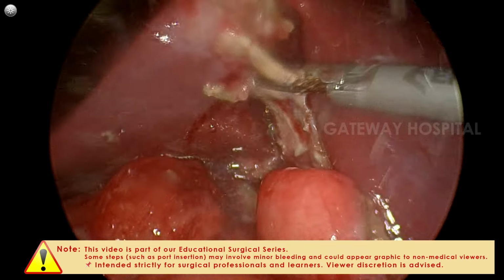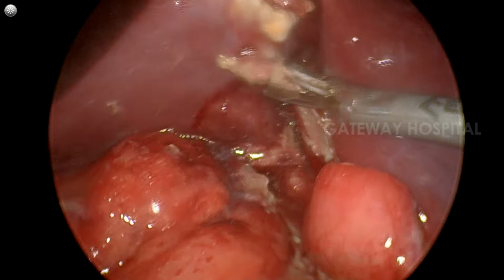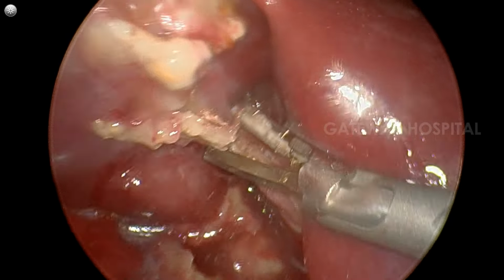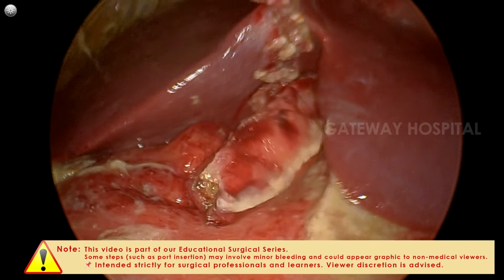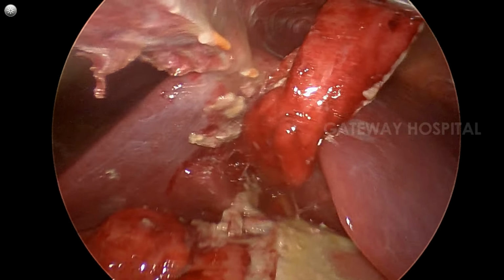There is no need to put additional ports to bring the falciform to the proper place for closure of the perforation. If you are using omentum, then sometimes you may need to place additional ports to keep the omentum in place at the time of suturing.